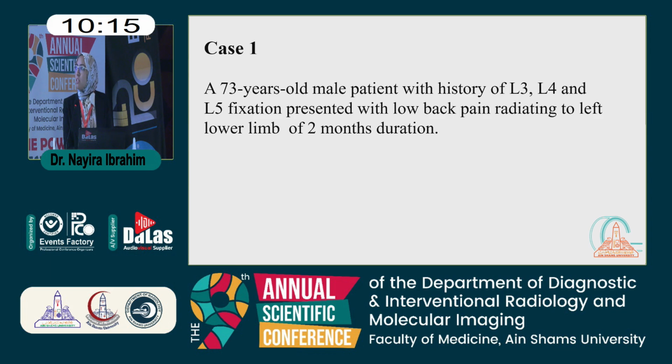I would like to present some of our cases. First, a 73-year-old male patient with history of L3, L4, and L5 fixation presented with low back pain radiating to the left lower limb of 2-month duration. His clinical manifestation was correlated to the level above fixation. The orthopedic surgeon was suspecting adjacent segment disease, and our study showed the following.